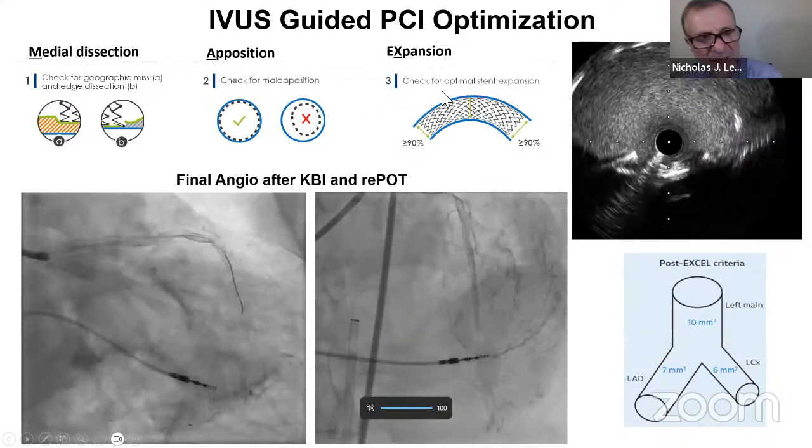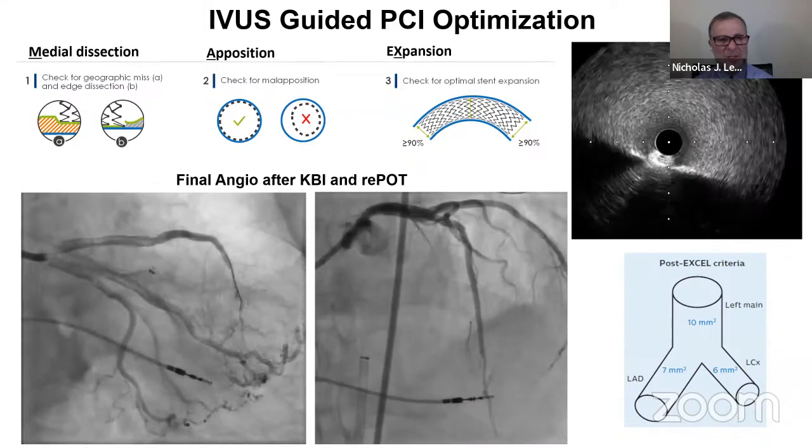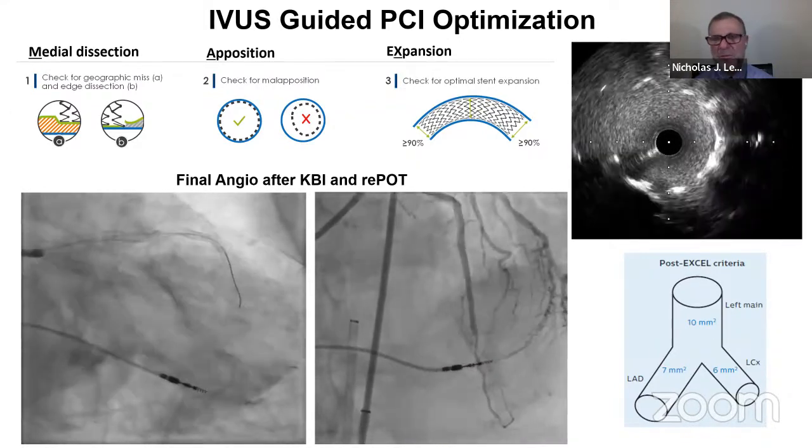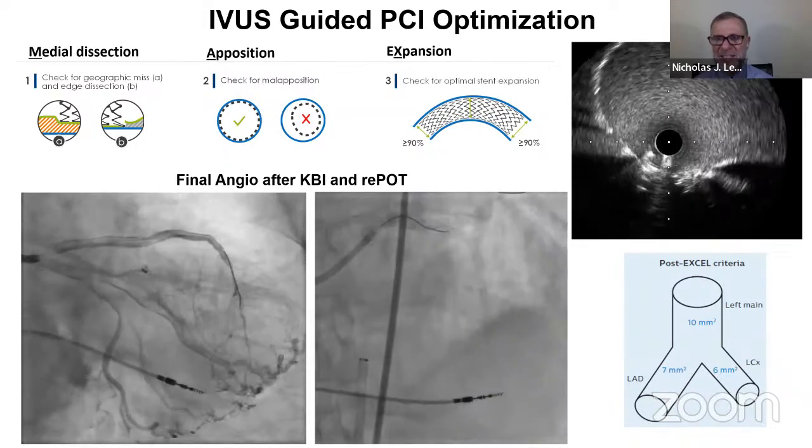That was an excellent case. I was going to ask you a question, and I think that may be related to your next case. You got a calcified nodule in the left main.